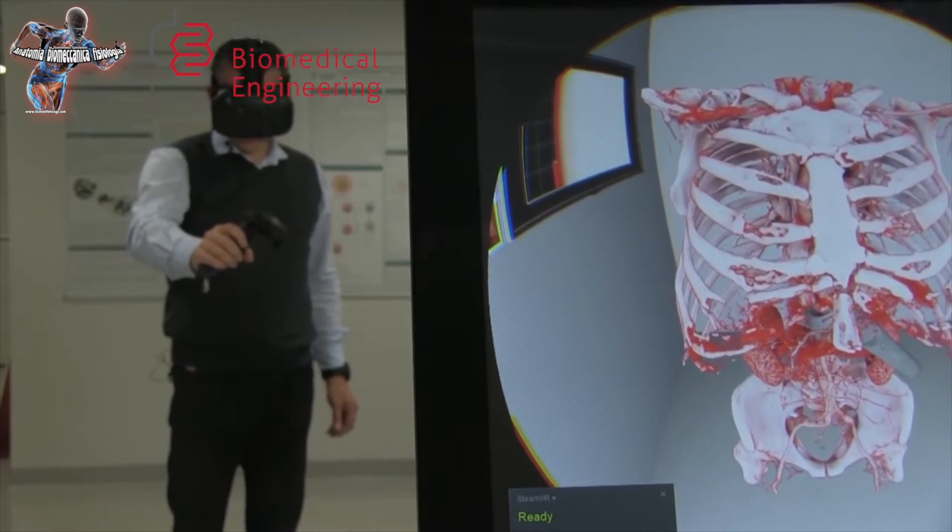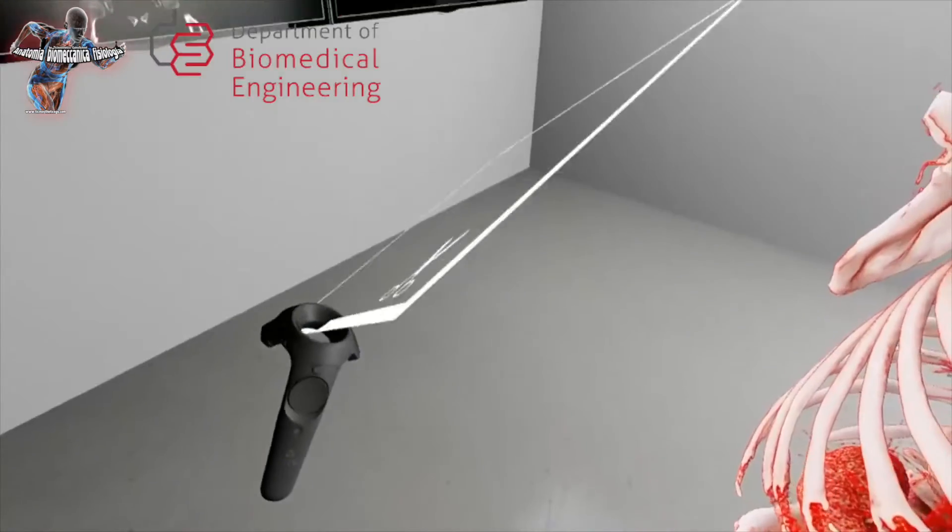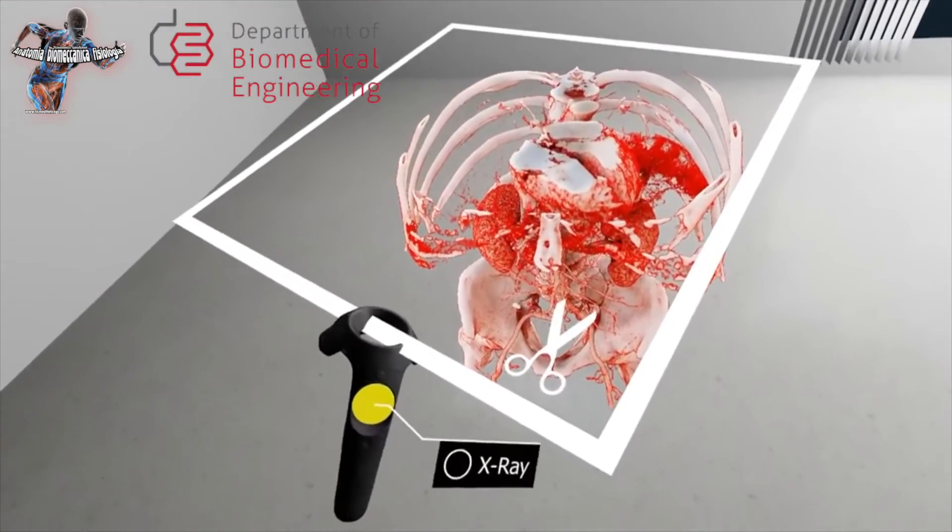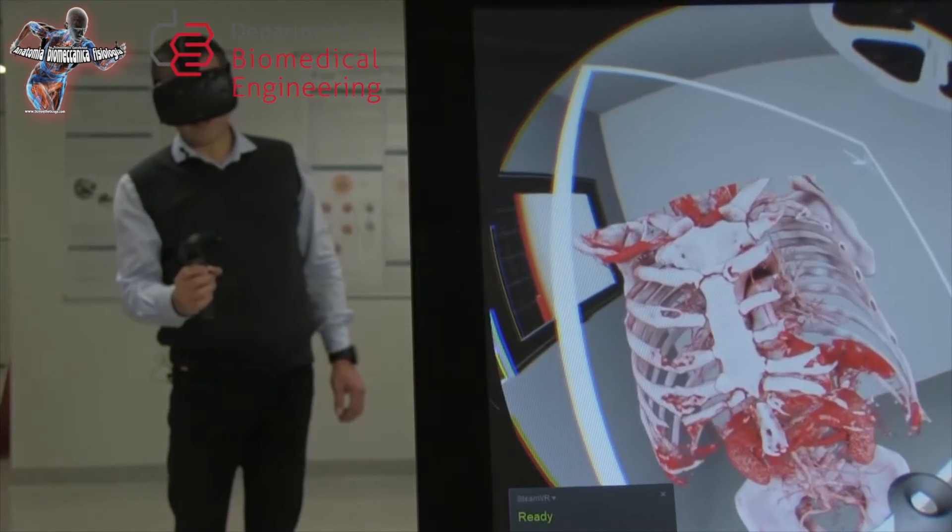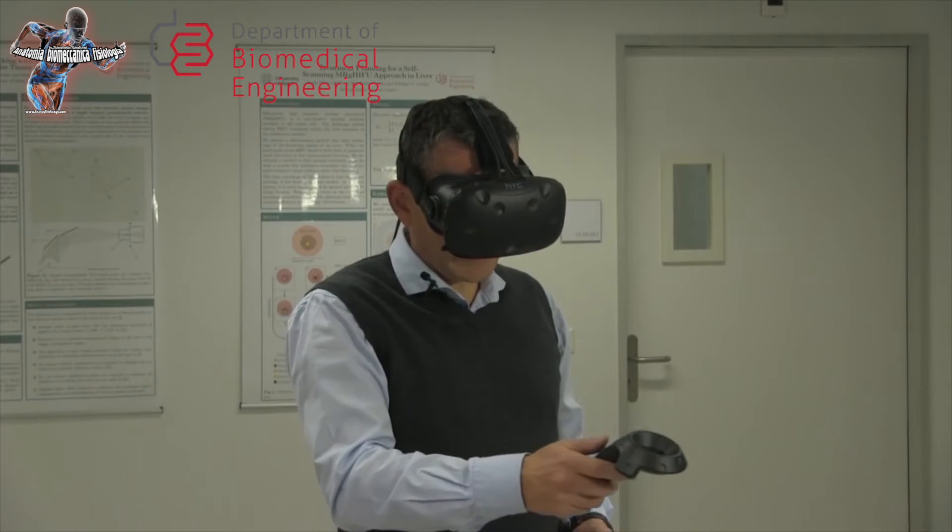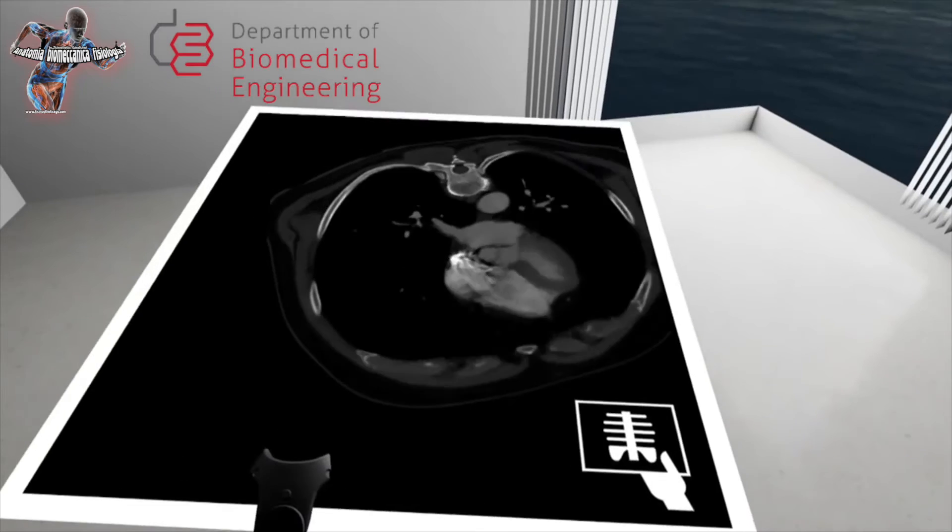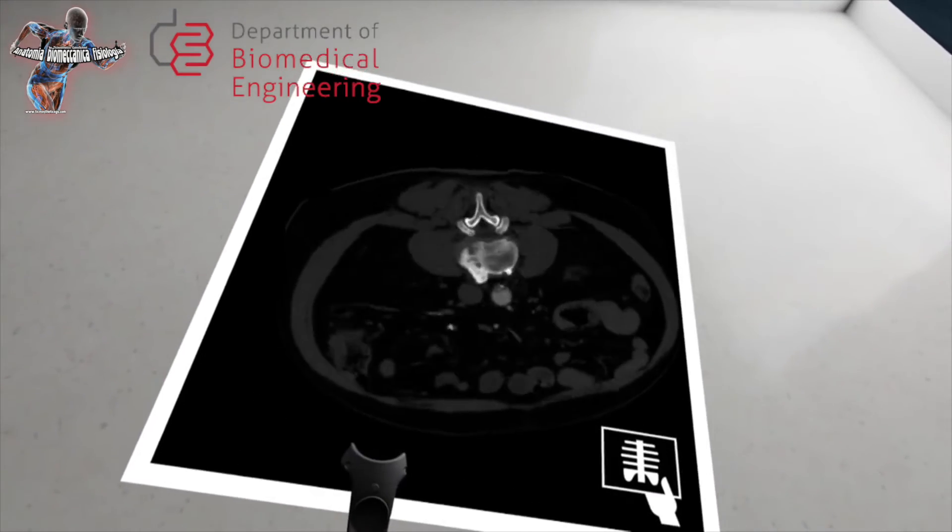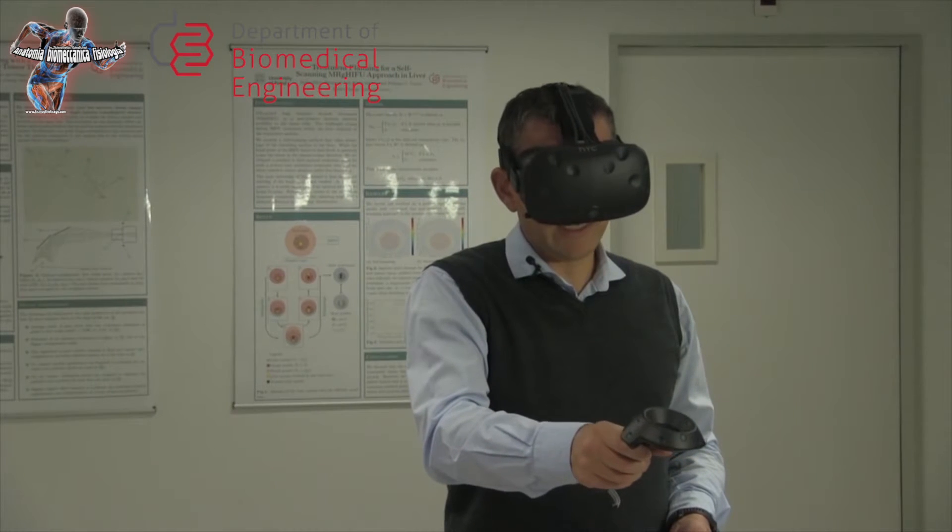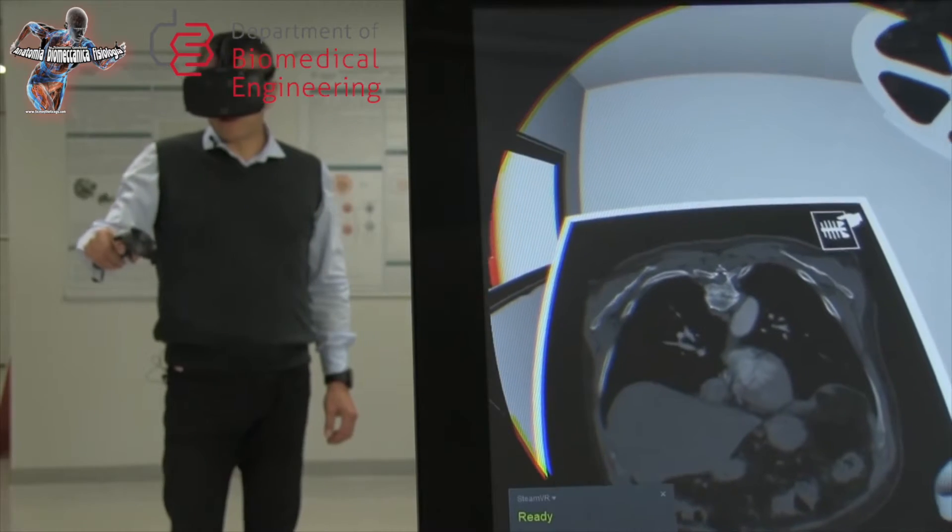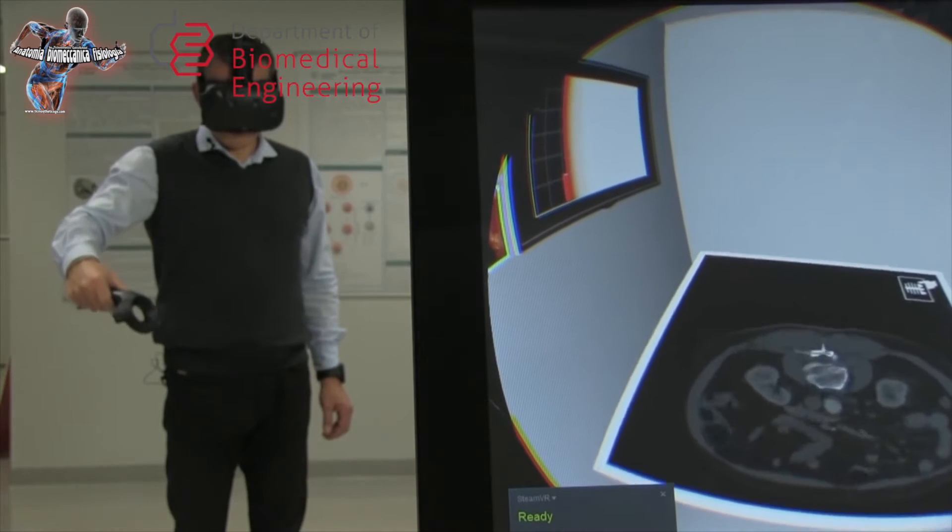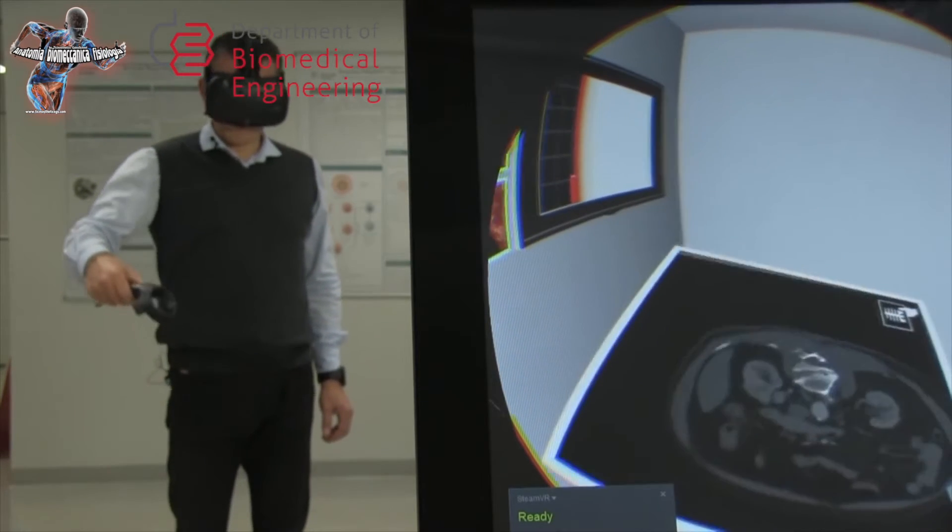As an additional option we also gave them a cutting plane. This cutting plane can be used to either cut through the volumetric data set, to for example cut open the skull or the rib cage for a better view of the scene behind it, but at the same time I can also switch this cutting plane into the CT mode. So I have a plane which is freely moved around and visualizes the CT, the original CT data set behind the scene. This virtual reality room provides a very intuitive way of positioning these cutting planes in 3D space.